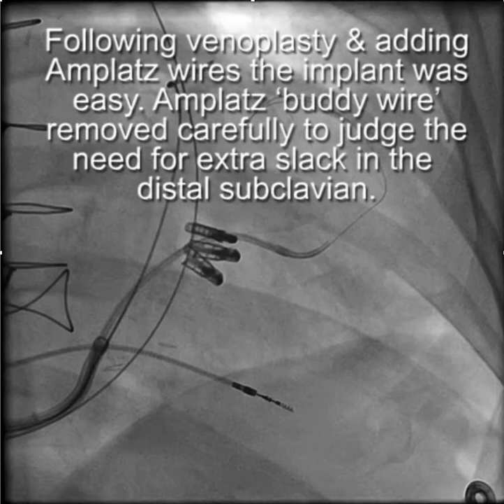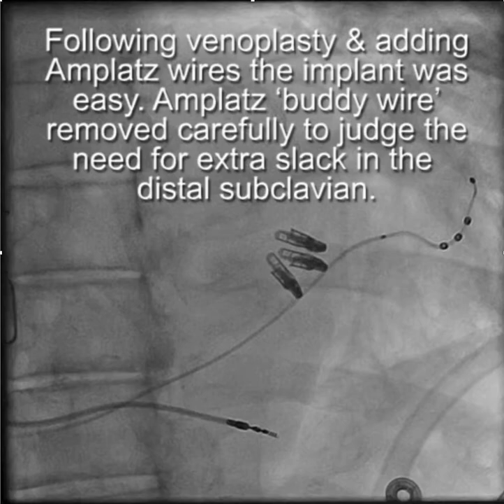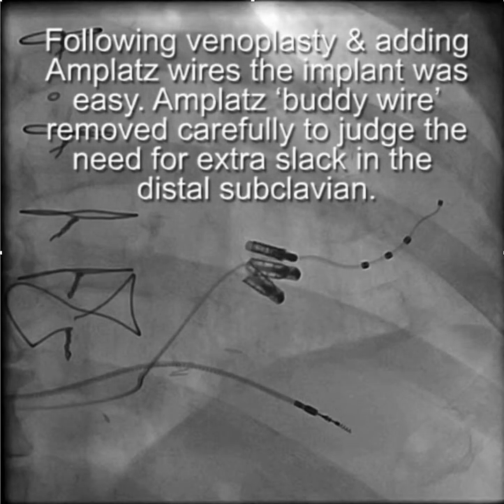Following venoplasty and adding the Amplatz wire, the implant was easy. The buddy wire was removed carefully at the end to judge the amount of slack that might need to be added.